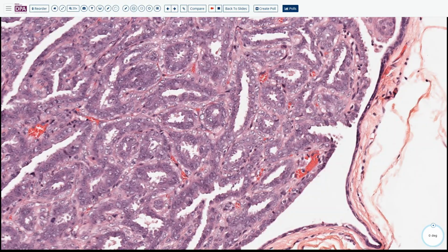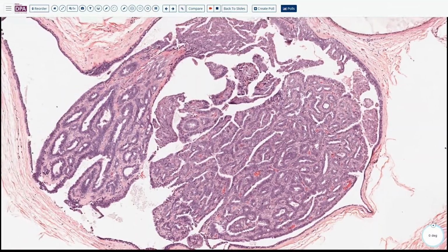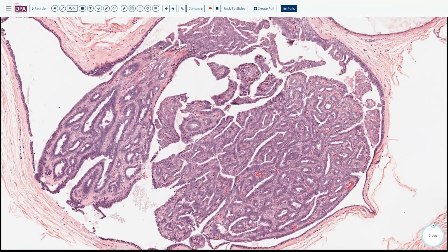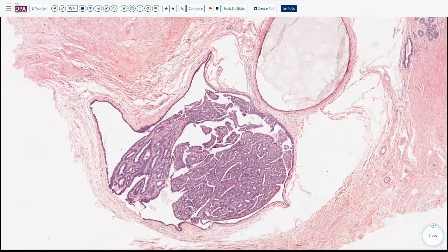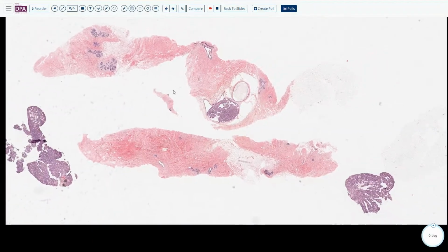Compared to this luminal cell, we already know we have at least a heterogeneous population. When you screen all the papillary lesion and everything just looks like this, you can be reassured this is totally benign. So this is intraductal papilloma. This one is really straightforward.